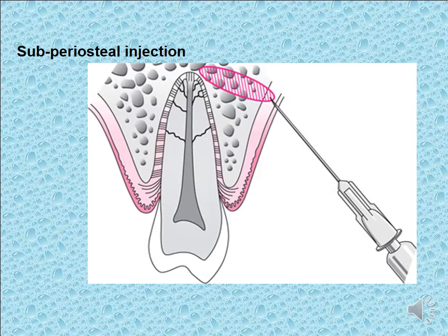At the start of giving this, the patient may feel pain due to stripping of the periosteum from the compact bone. Then the local anesthetic solution can enter through the cancellous bone to the apex of the root of the tooth that needs to be extracted. This is a somewhat annoying procedure for the patient, but the amount of anesthesia needed is small because it is mostly cancellous bone and does not need a huge amount of local anesthetic solution.